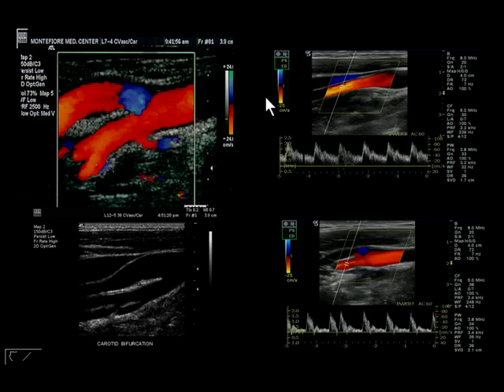But really the primary way to tell the difference is by looking at the waveform, so that when we look at this vessel here, the one located more anteriorly, we see a waveform that yields continuous forward flow throughout diastole, much more diastolic flow than its counterpart, the external carotid artery, which has a sharper peak, much less diastolic flow. And here in this 2D image, without color, we can see the presence of several branches. All of this confirming that in fact we are looking at the internal carotid artery in this vessel and the external carotid artery here in the far field.